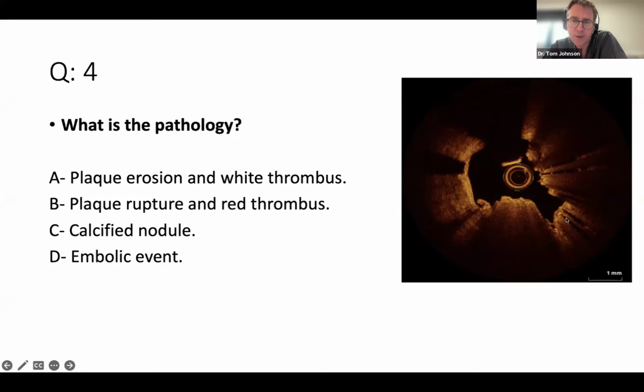Yeah. So cholesterol crystals can cause a very bright reflectance. They often don't cause the attenuation. This is, I think, most likely to be stent struts within a failed stent with eruptive or protrusive nodule or thrombus adherent. And then again, you have this attenuating, protruding surface from 5 o'clock through to 7 o'clock.